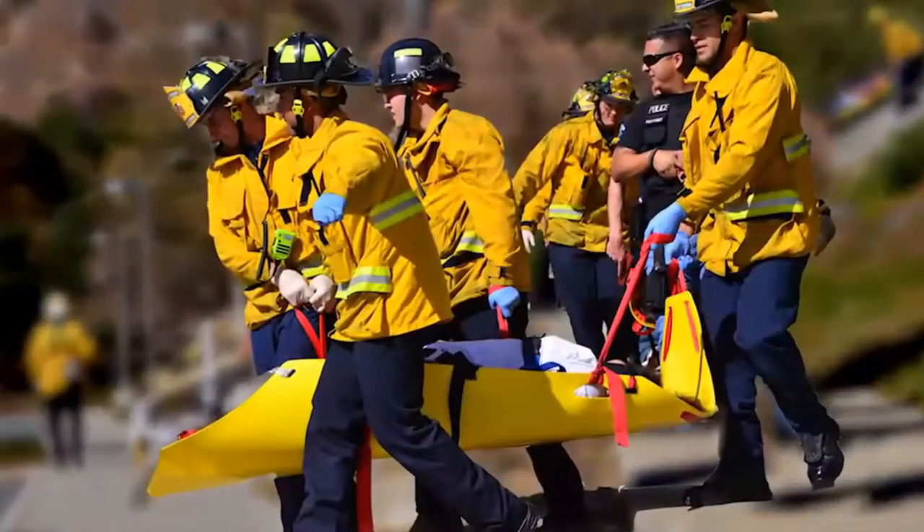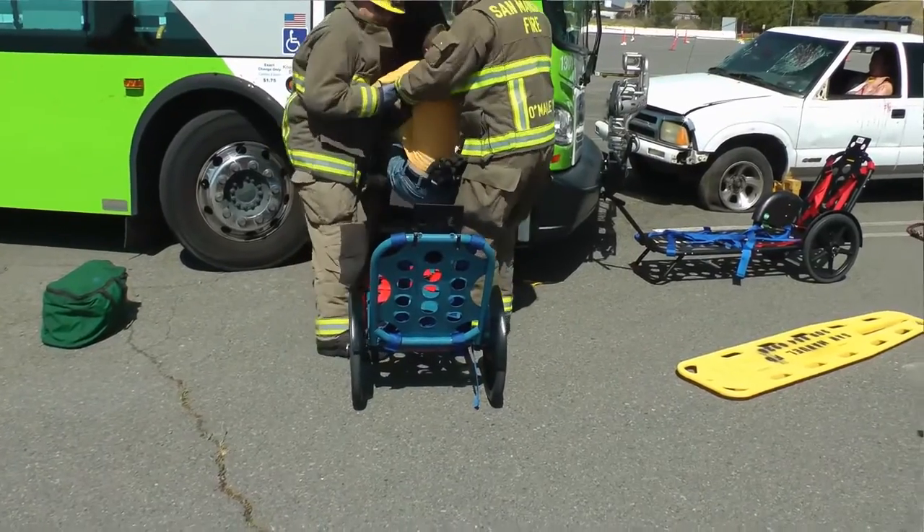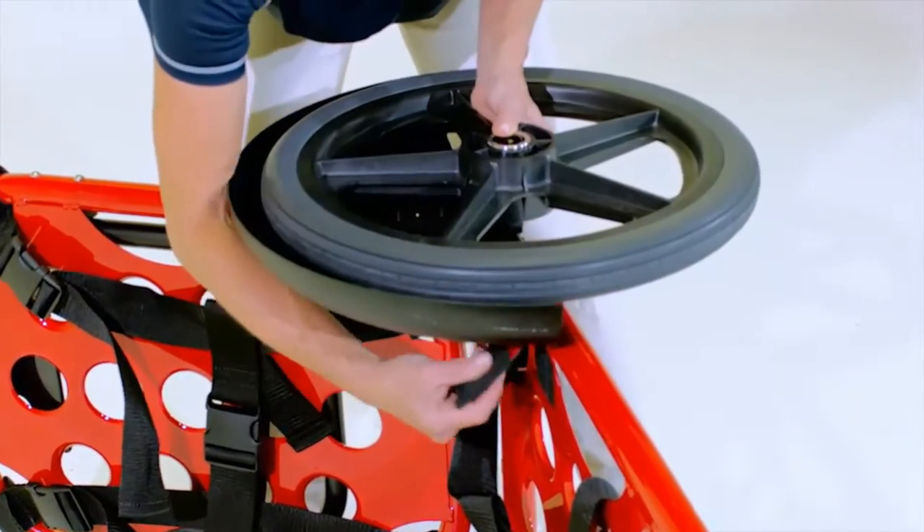One responder can move a patient to safety more efficiently than the traditional four to six responders, and the Rex can also be utilized to move heavy equipment. This eliminates the need for additional carts or dollies, and once at the site, the Rex is ready for use. Its interchangeable tire system allows the Rex to be used in various terrains and conditions, from beach or sandy surfaces to mountainous terrains.